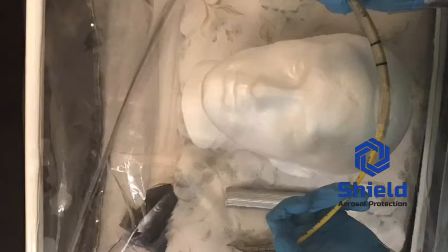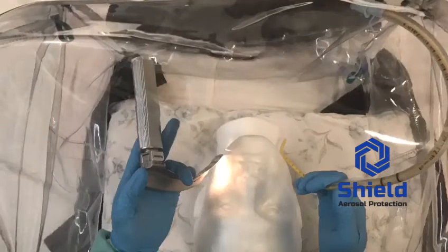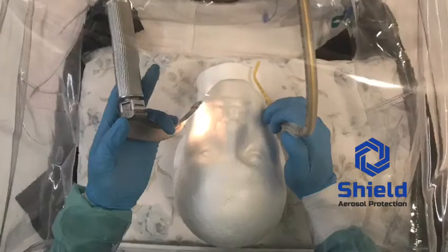The positioning of the tube nicely contours the tent that is above and is not in any way resistant to the passage of the tube. It actually holds it in place quite nicely.